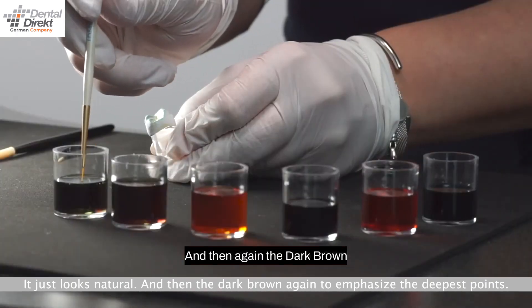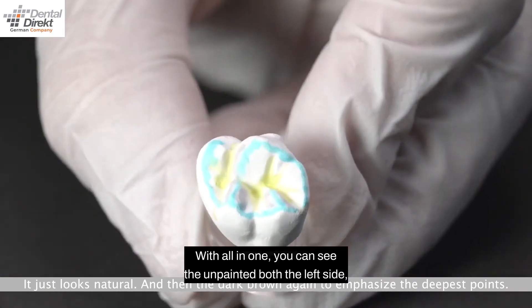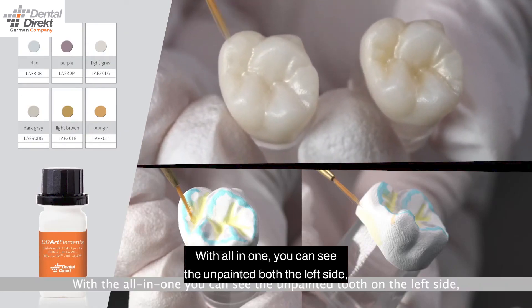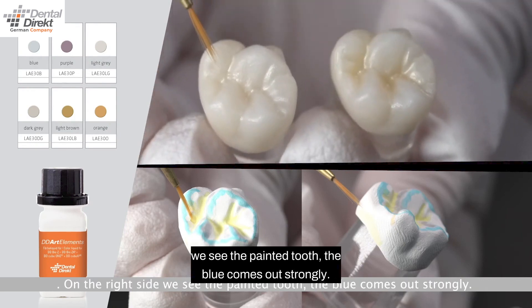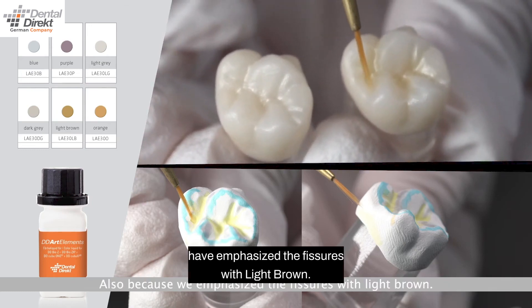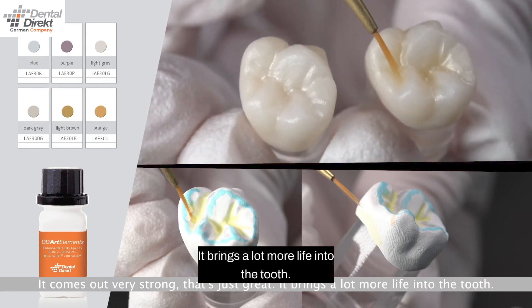Then again the dark brown is applied around the lowest points to be emphasized. With the all-in-one view, you can see the unpainted tooth on the left side and already see a big difference. On the right side we see the painted tooth — the blue comes out strongly, also because we have emphasized the fissures with light brown. It comes out very strong. It brings a lot more life into the tooth.